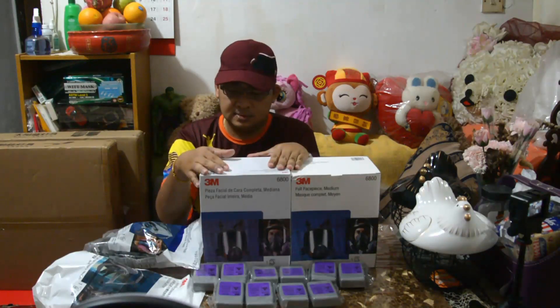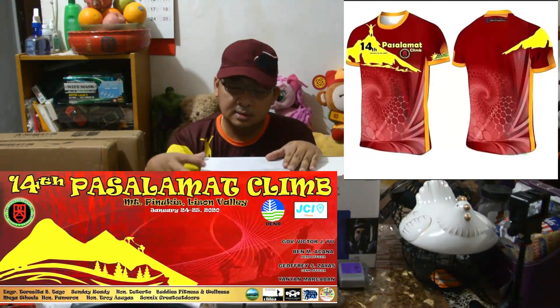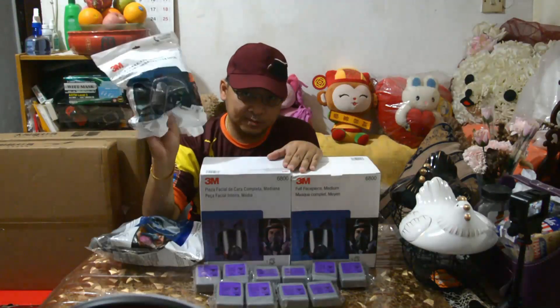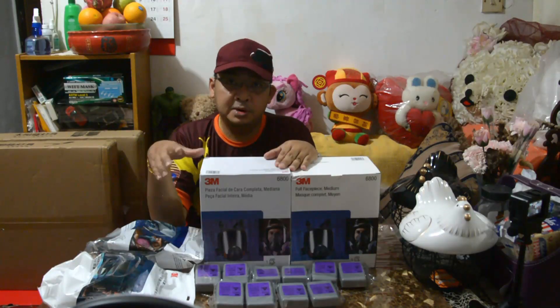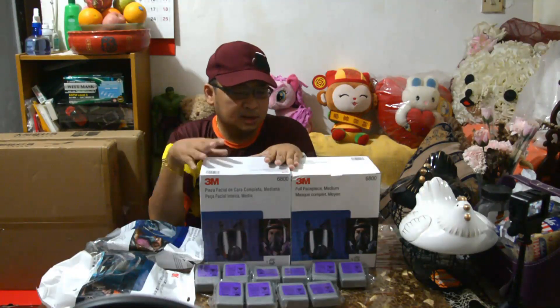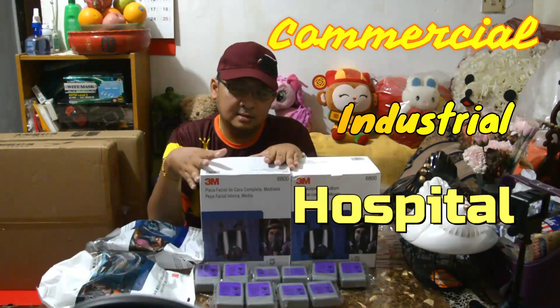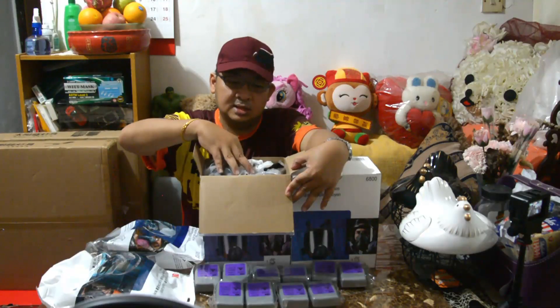Kasi tatlong klasi: yung full face, yung half mask, saka yung isa — half mask pa rin siya pero large. Kapag kita ko sa inyo kung ano yung code number sa tatlong to, sa medium saka sa large na mask. Ito ay pwede sa commercial, industrial, sa hospital, sa painting — depende sa gamit niyo. Pero ito ay nagamit sa hospital. 6800 yung code niya.